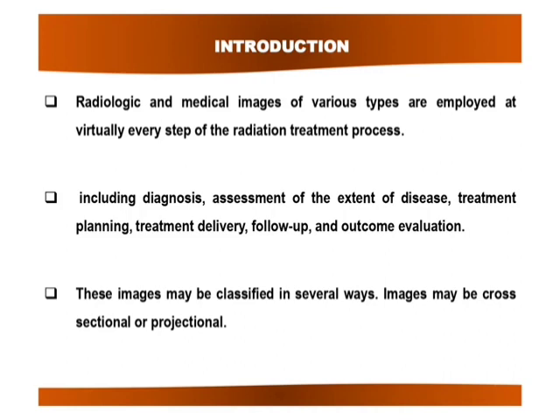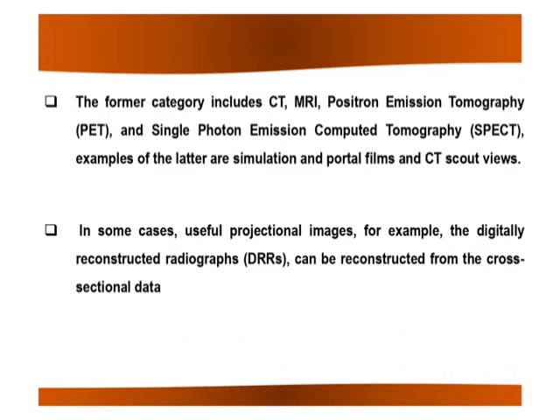And then there is day-to-day movement and beam alignment, and though it is precisely the duty of trained radiotherapy technicians to align these, a safety margin is also given, that is the setup margin. So now if we combine GTV, CTV, internal margin, and setup margin, we conclude the PTV, which is required to be irradiated. We also consider the area nearby, the organs at risk, so as to limit the radiation to them.